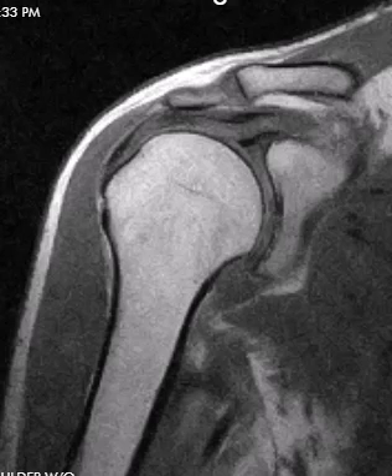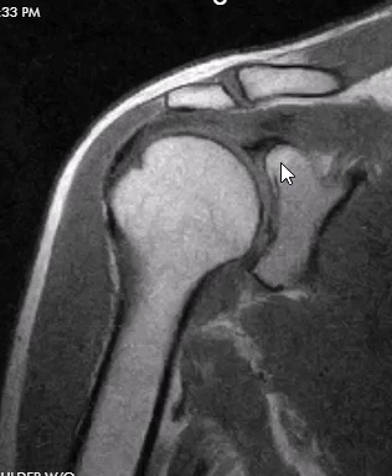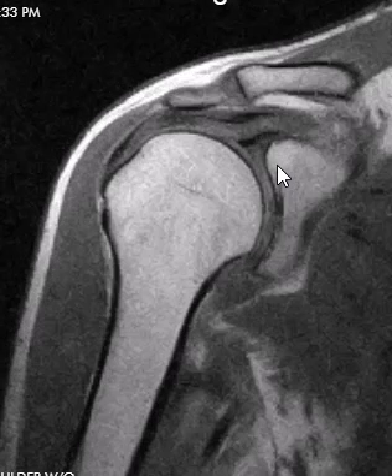If we look here on this coronal T1 image, we see a really nice glenohumeral joint. The humeral head is nice and smooth in contour, there's no erosion or spurring. The glenoid also looks very, very nice, and we see the labrum is intact.